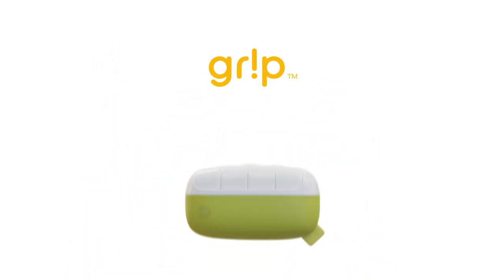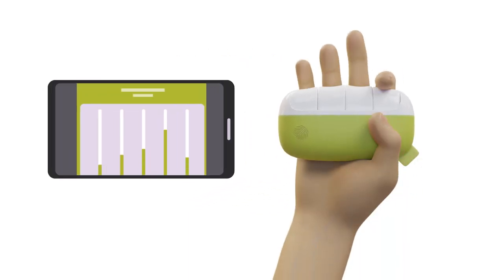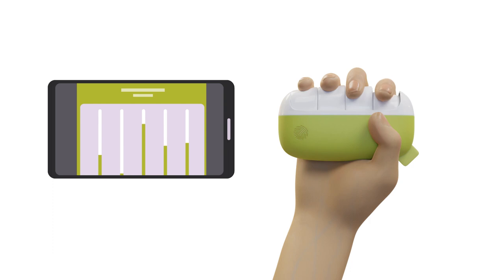That's why we developed Grip, a smart remote therapy device and app that guides users through therapy protocols and monitors progress from home.